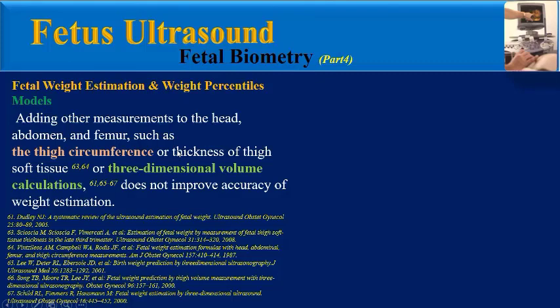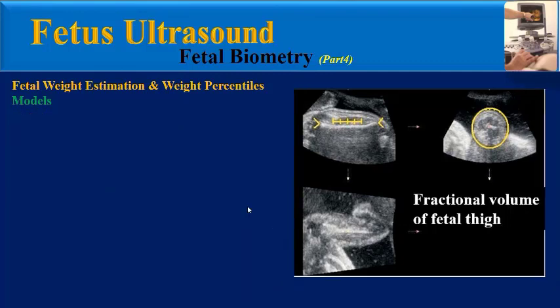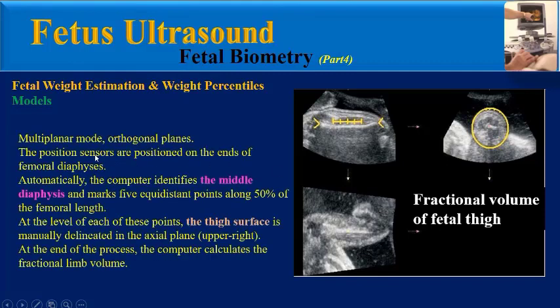According to many studies, adding other measurements to the head, abdomen, and femur — such as thigh circumference, thickness of thigh soft tissue, or three-dimensional volume calculations — does not improve accuracy of weight estimation. This 3D ultrasound image was taken by multiplanar mode and orthogonal planes technique.